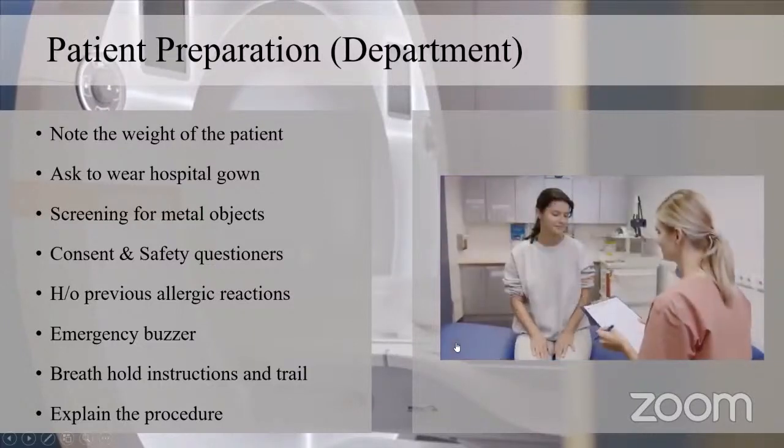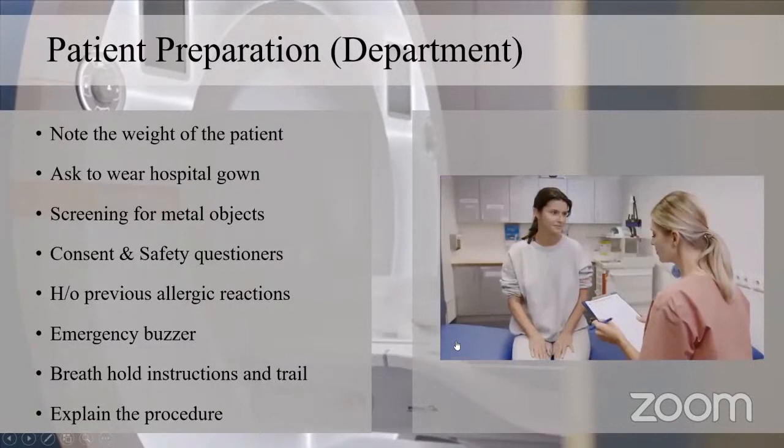Next, we have to take a consent. This consent should be written and informed, and explained nicely to the patient. And there will be safety questions, like the history of any previous allergic reactions or surgeries, etc.